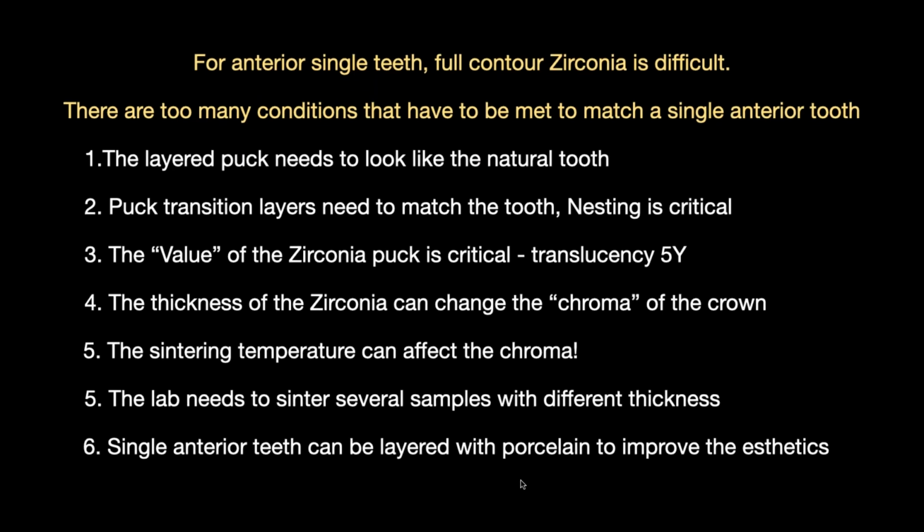And of course, the heat absorption is totally different. That's why sometimes when you fire your porcelain or you glaze, the pontic doesn't glaze the same as the abutment, because you have air all around the abutment and it's thin compared to a pontic, which is quite thick. So you need to have a really slow bake time for whatever you do. When you have a big, thick piece of zirconia, you have to give it plenty of time to heat up to be able to accept the glaze or the porcelain. The single units will heat up a lot faster.